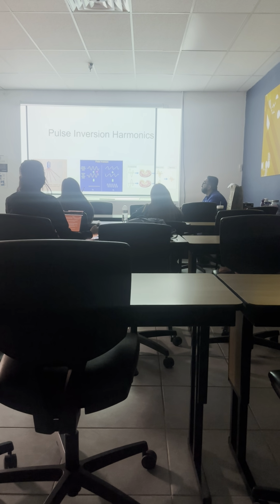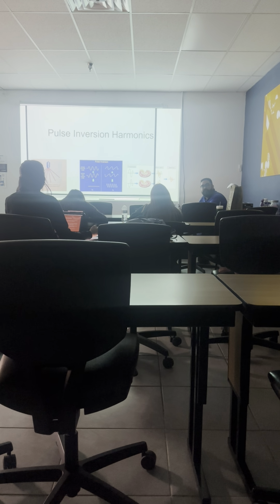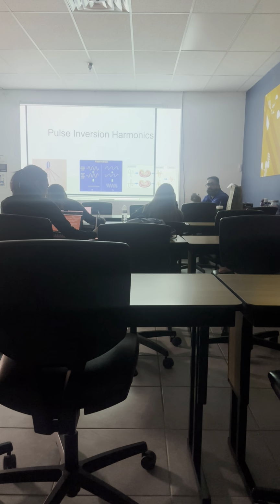It's inverse. Just like in constructive interference, when two waves are completely out of phase, they're the exact opposite of each other, right? So they cancel each other out. They're completely out of phase, they're the inverse. What's left is this nonlinear harmonic that is not completely out of phase, so it comes together, it joins, it constructively interferes to make a more intense pulse. Okay?